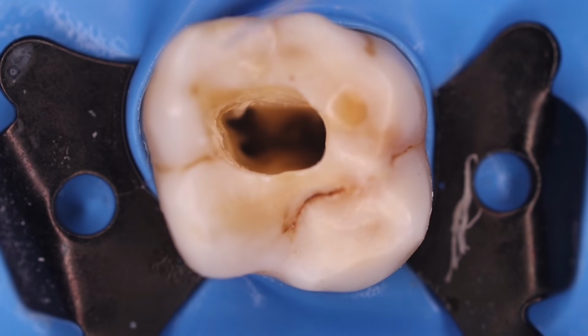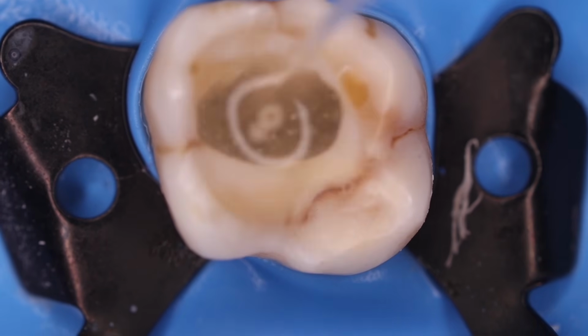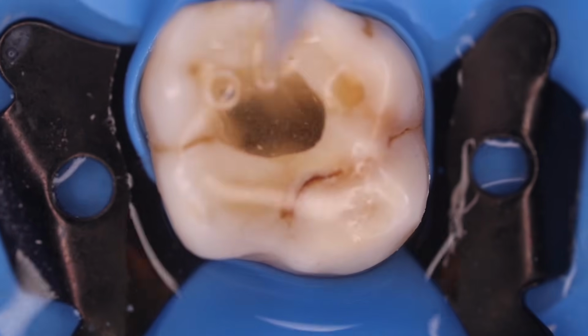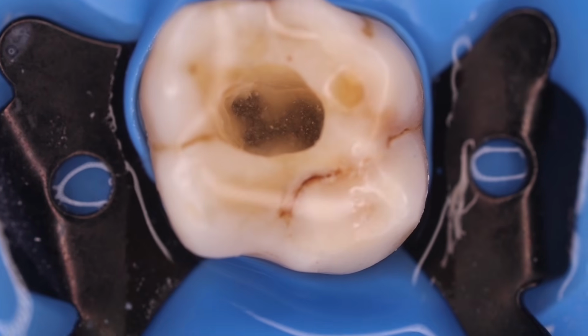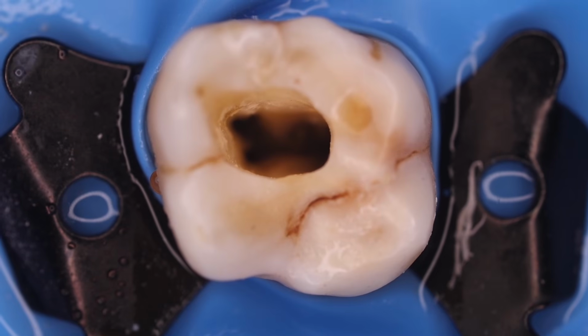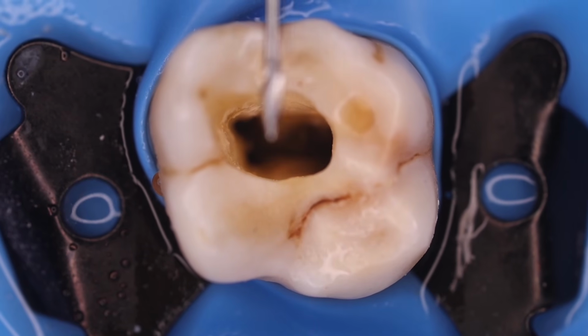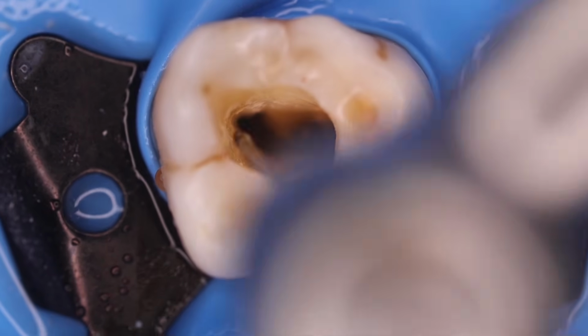After size 1, irrigate the canals with the help of a side vent needle. Now let us proceed with size 2 of the Gates Glidden drills.